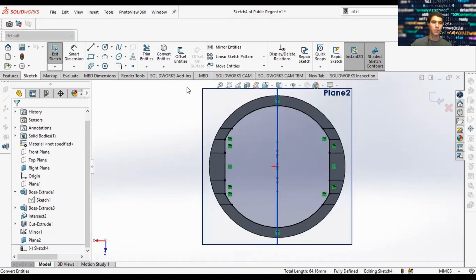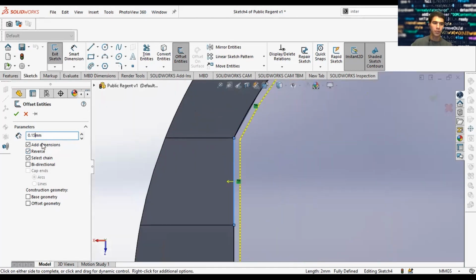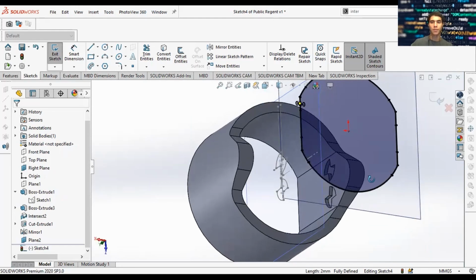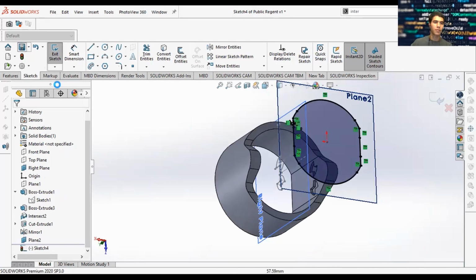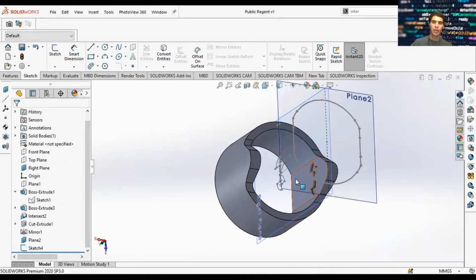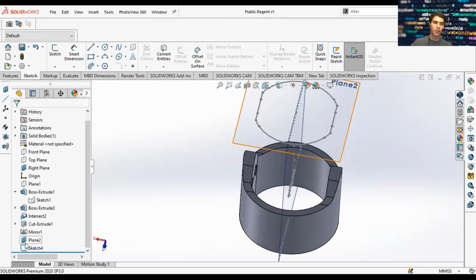So now we're going to offset entities with this chain that we have. And I'm going to reverse it. So there's the gap, which is okay. This is what we need. It's on top of this plane. Do a quick save and rebuild. This is what we have so far. Cool. We're going to hide this plane for now.